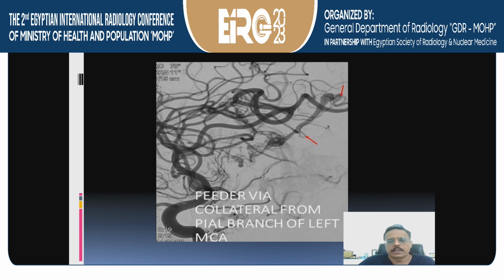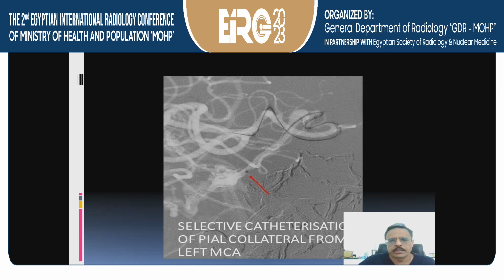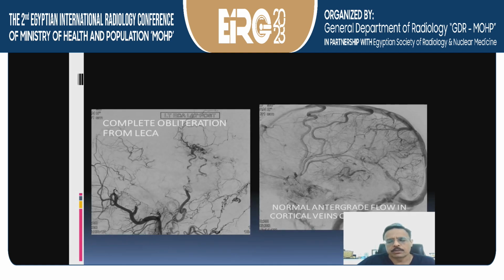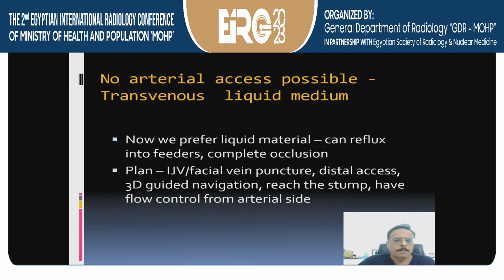And then you can see there are feeders coming from the leptomeningeal artery. The above arrow points to a very small vessel, and then an anastomosis forms a collateral route to a middle meningeal artery filling retrogradely there. And so from this PL vessel, we could go on to the dural vessel again with the detachable tip microcatheter, and then once you reach the nidus, you can do a very deep penetration, including the veins, to get a complete occlusion in such a challenging patient.